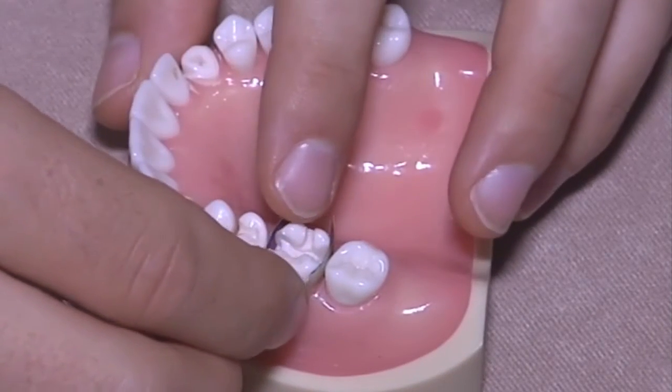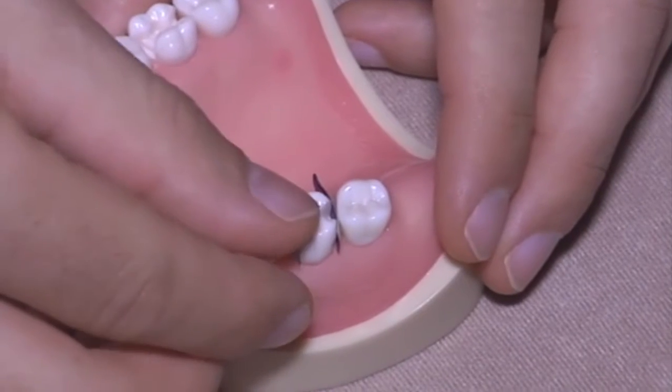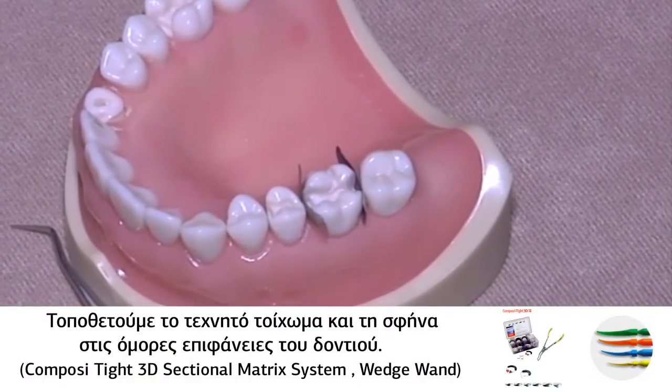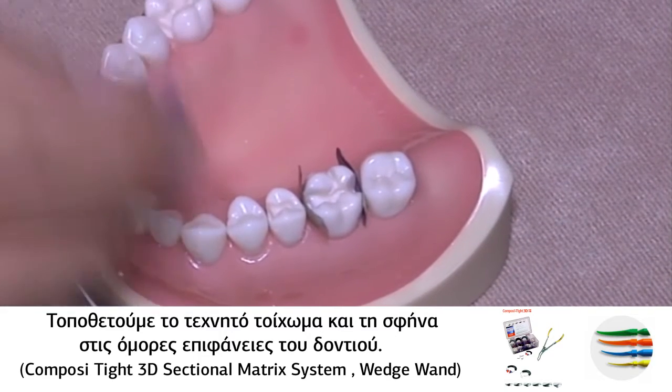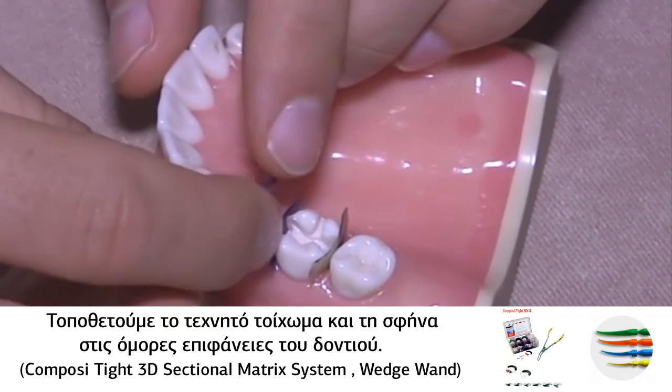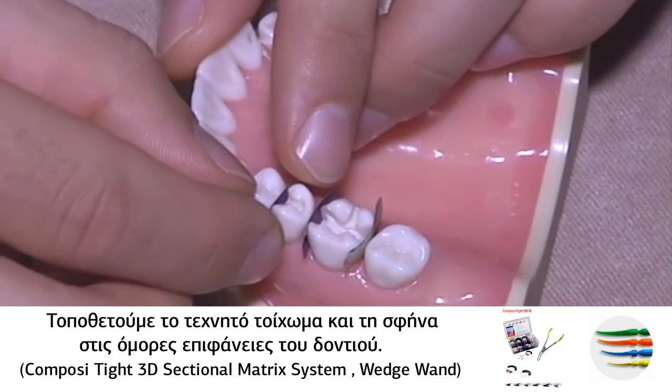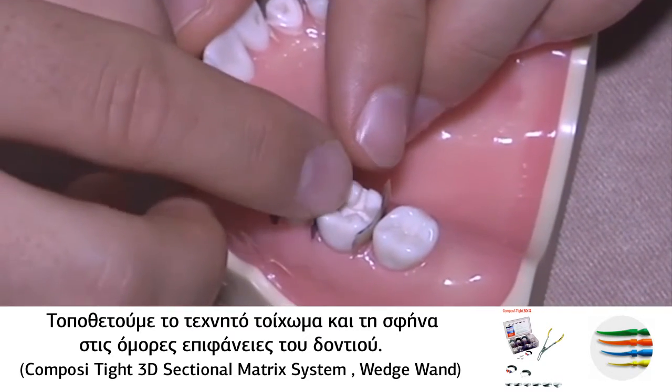In these multiple cases, I use forceps usually, not fingers, of course. And then I will move the ring based on the tooth I am restoring.